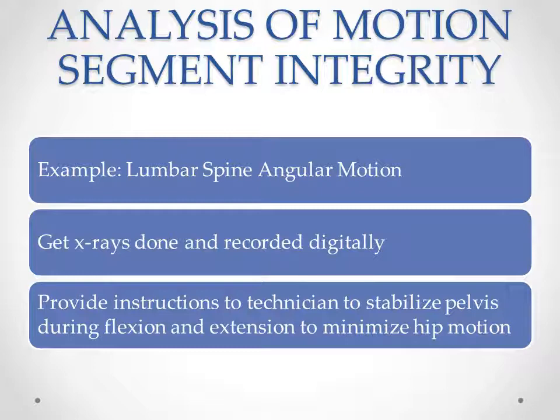Also, make sure to provide instructions to the X-ray technician that they stabilize the pelvis during flexion and extension to minimize hip motion. We're after pure lumbar spine motion.